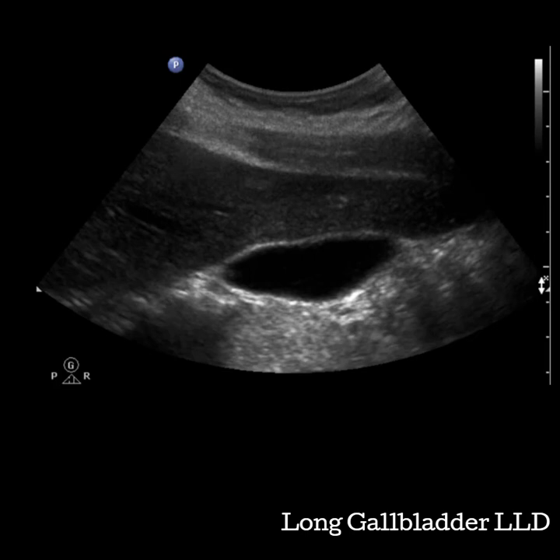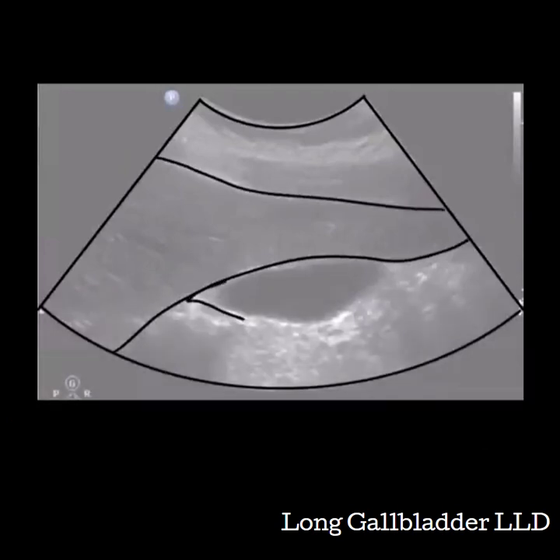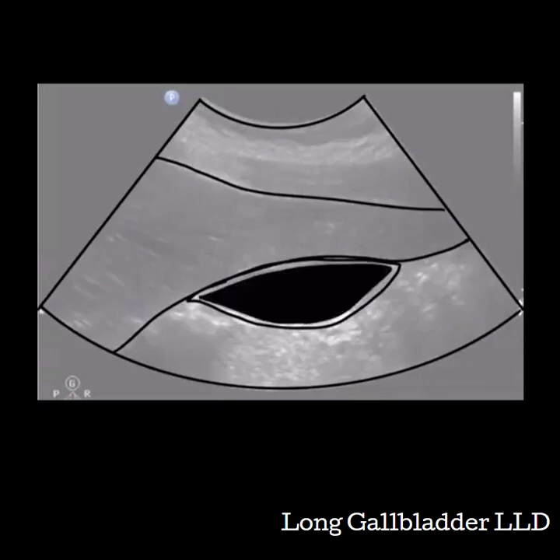The gallbladder shifts into more of a midline position with the fundus now more medially or hanging towards the patient's left side. After you roll your patient, it actually might be kind of tricky to find where that gallbladder went. Make sure to watch your transducer, move it to the patient's midline, and begin looking for the gallbladder in the more medial position. The liver will still be anterior to the gallbladder with the duodenum posterior.